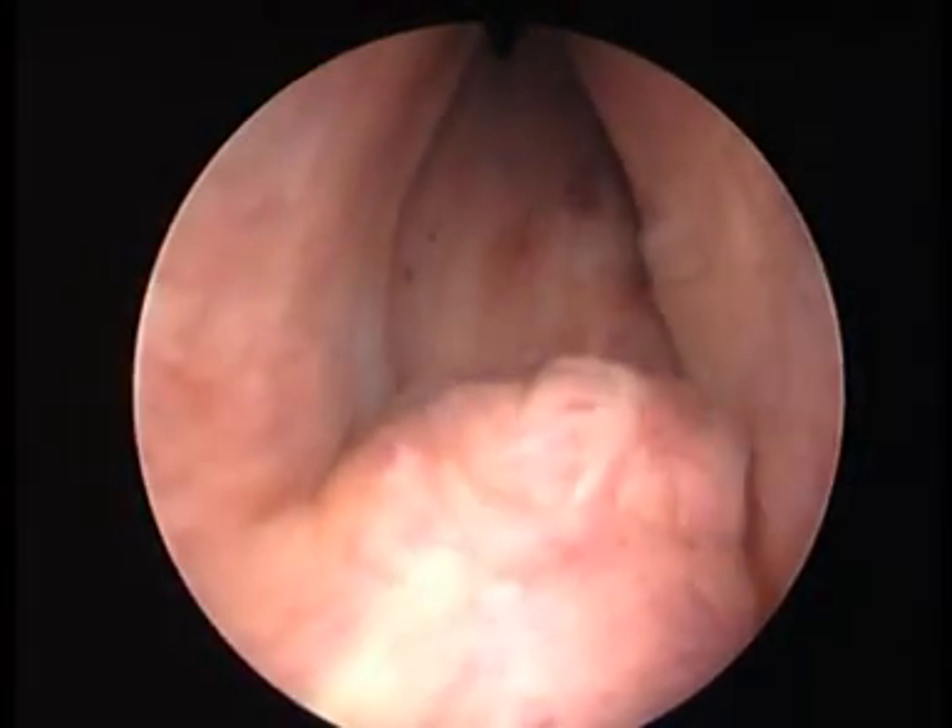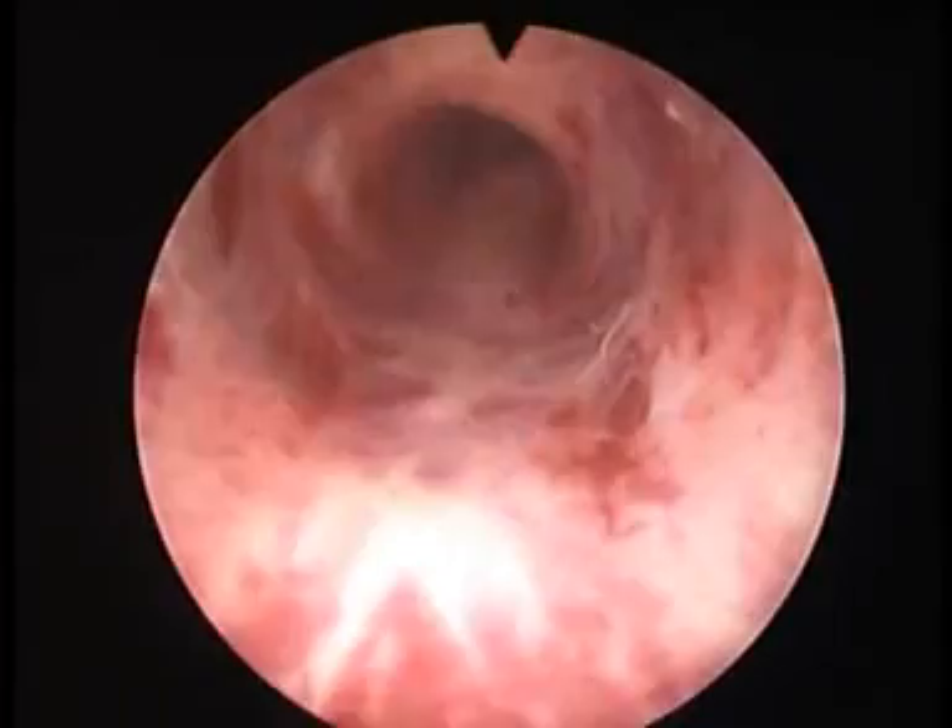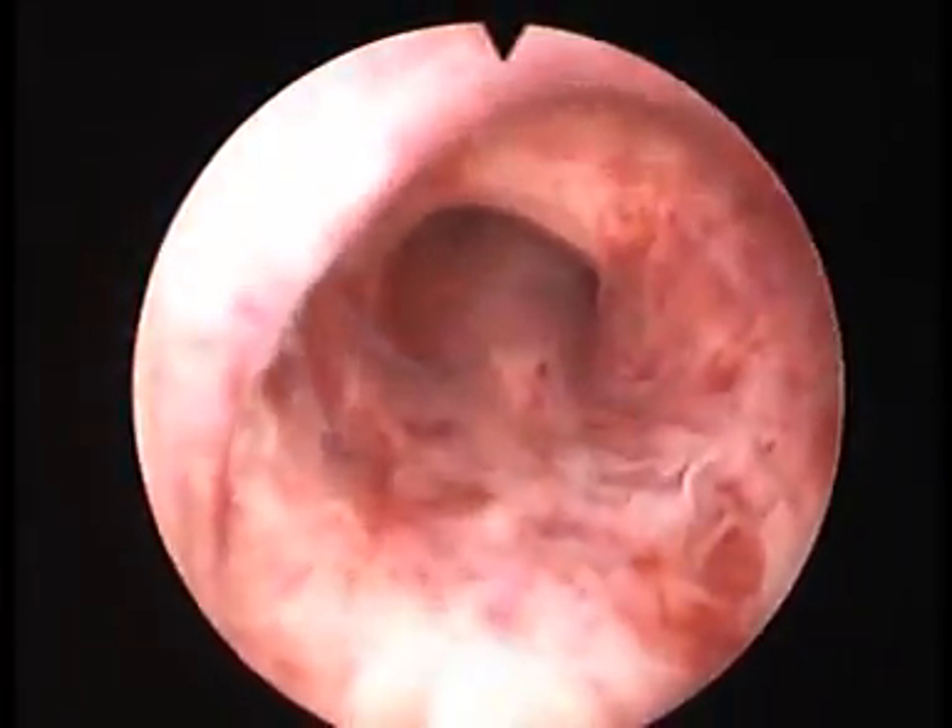In the center we can now see the verumontanum. We're moving back now toward the urethral sphincter, which is of course the continence mechanism.